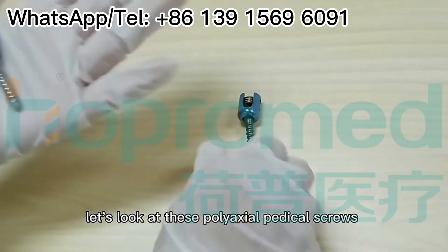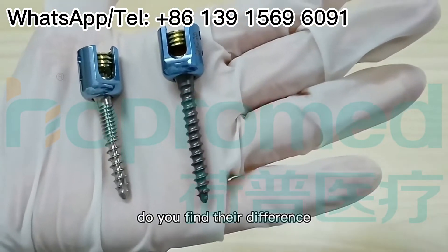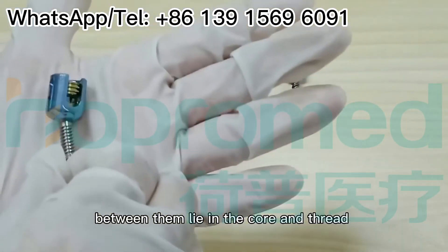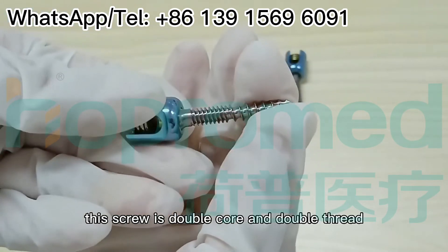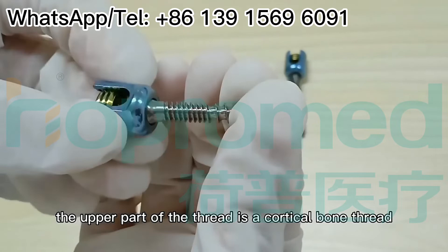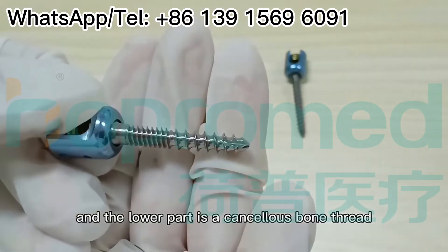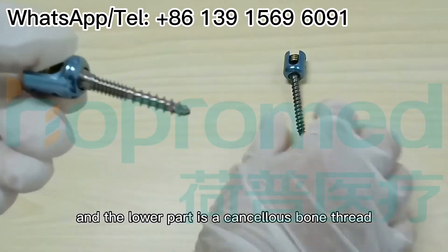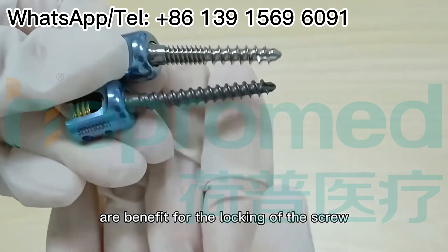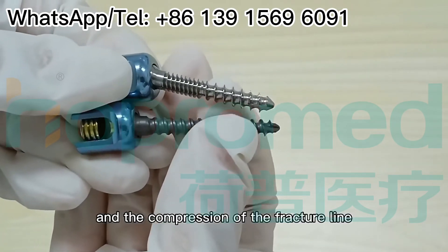Let's look at these Poly-axial pedicle screws. Do you find their difference? The difference between them lies in the core and the thread — this screw is double core and double thread. The upper part of the thread is a cortical bone thread, and the lower part is a cancellous bone thread. Double core and double thread are beneficial for the locking of the screw and the compression of the fracture line.